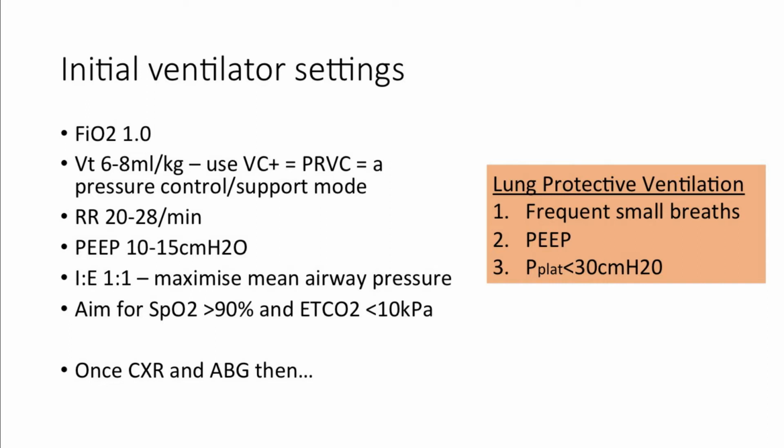And you're going to use a pressure control mode that's targeting a tidal volume. So you're not using volume control. On the ICU ventilators, it's called VC plus. It's not a great name because it's not volume control, it's pressure control. But you dial up a tidal volume and it gives a breath. It works out what tidal volume it gets for that breath and then it adjusts the pressure appropriately. I think on the anaesthetic machines it's called PRVC. It's called different things on ventilators, but the idea is the same. It's a pressure control that targets a tidal volume, which relates to your ideal body weight.